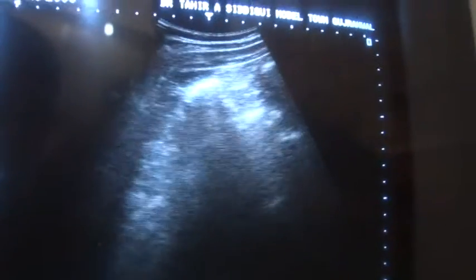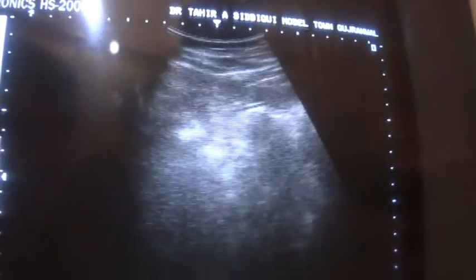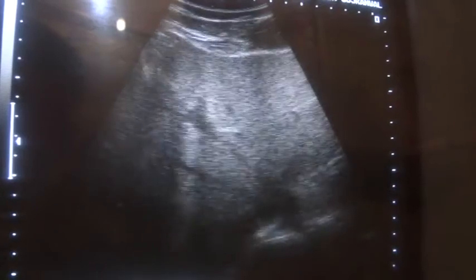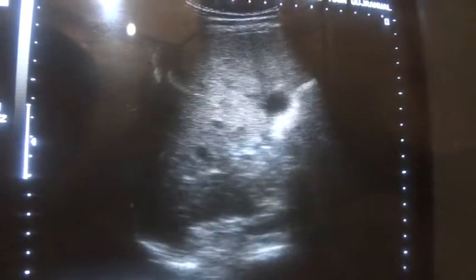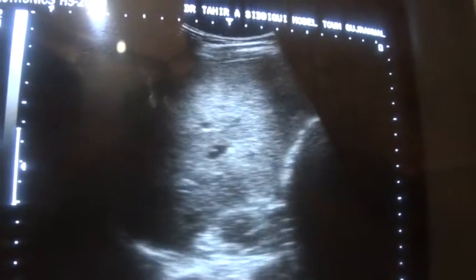This video segment is relating to an interesting finding, an incidental finding in the liver. What is your eye interpretation as regards grading of this liver?